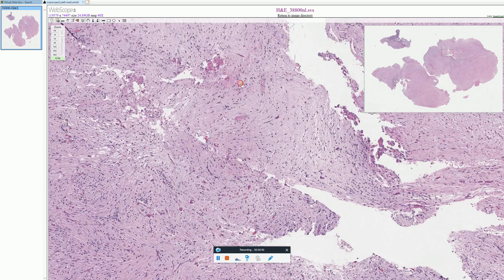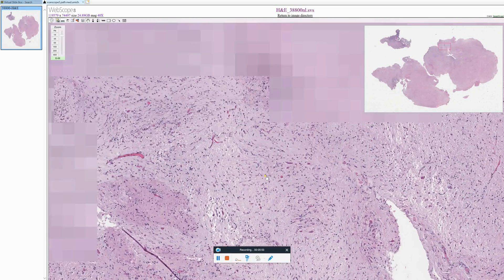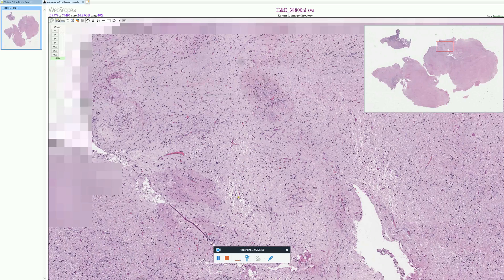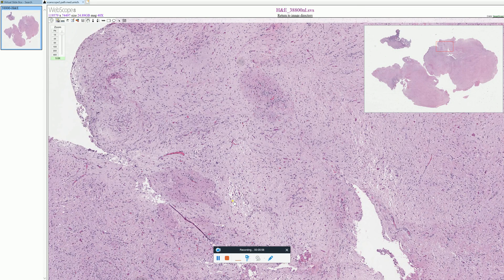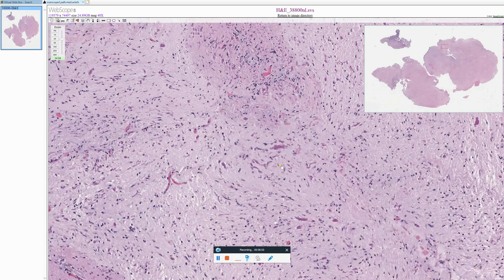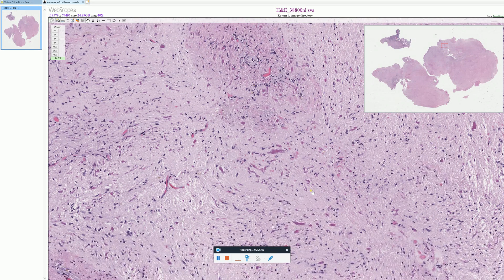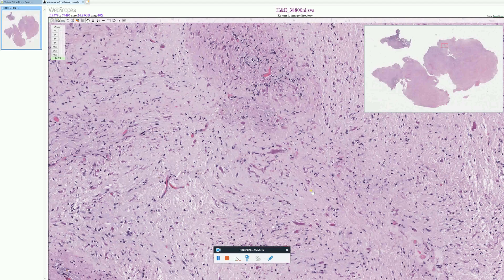Keep in mind that pilocytic astrocytomas can have a variety of appearances, ranging from more loosely arranged areas to more compact fibrillar areas. But typically, if you see Rosenthal fibers, pilocytic astrocytoma really does need to be high up in your differential. That completes today's session for Adventures in Neuropathology. Please join us next time. Thank you.